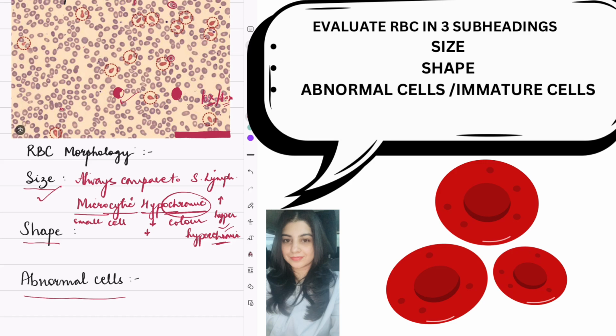Now next is shape. So what is the normal shape? Normal shape is biconcave, and in 2D you will see oval. So this oval is normal, but as anemia progresses or hemoglobin becomes less, cells assume different morphology. So it can be anything.